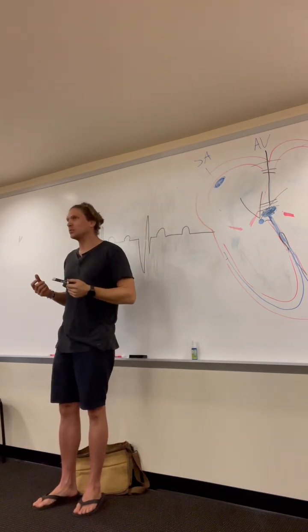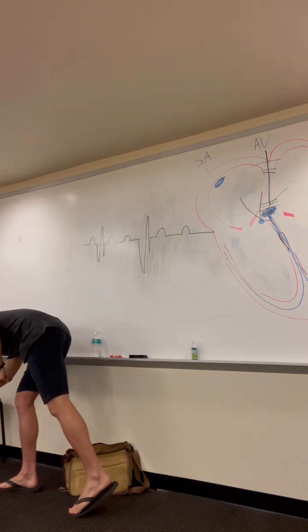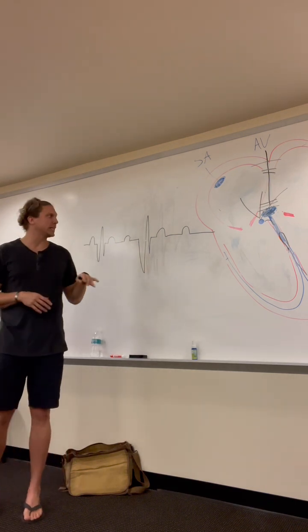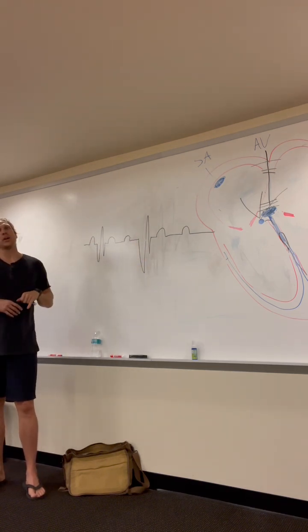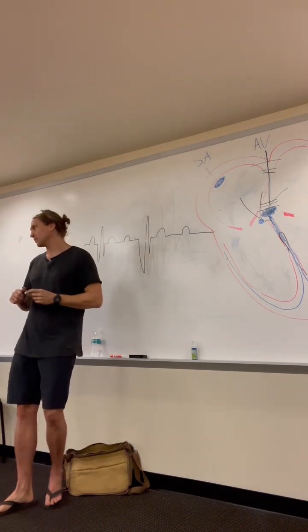And then my interval. So look at these intervals. First one is a prolonged PR interval to begin with, so I know it's a heart block, at least a first degree heart block. And then you follow through and look at these PR intervals. Do they get longer or do they run? So if it's running, running, running, drop, type 1 likes to run. Second degree, type 1.